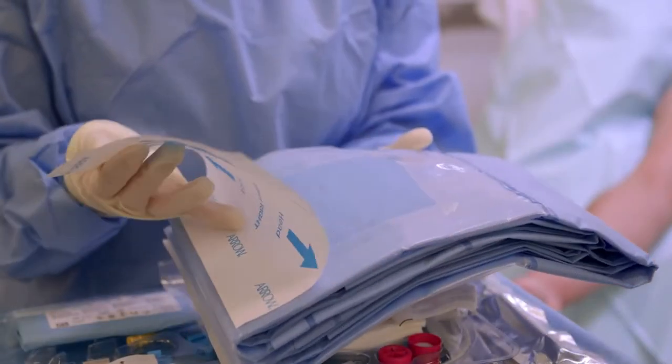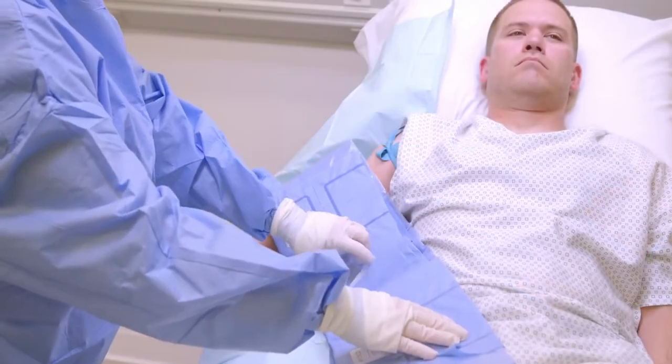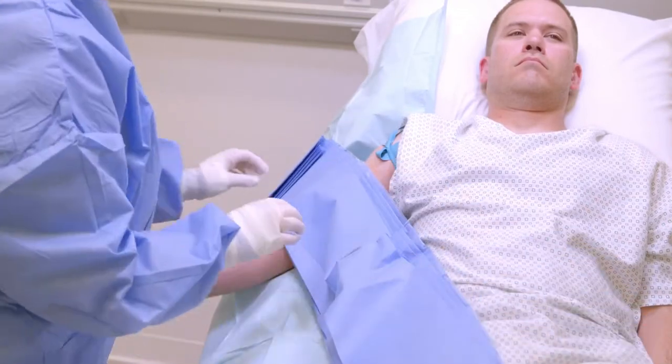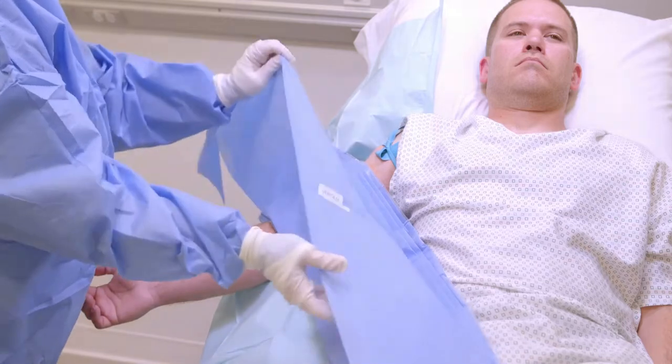Expose the adhesive strip on the underside of the fenestration and drape the arm, ensuring that a sterile field is maintained and that the fenestration is centered over the planned insertion site.